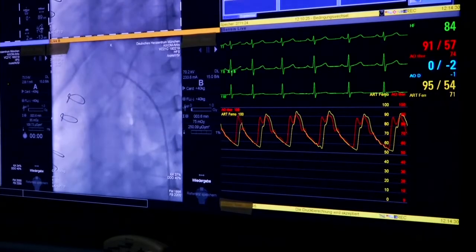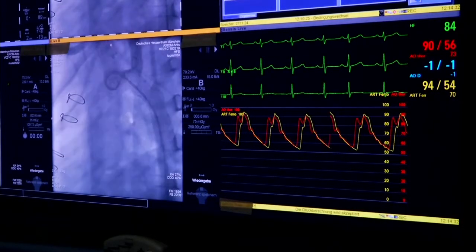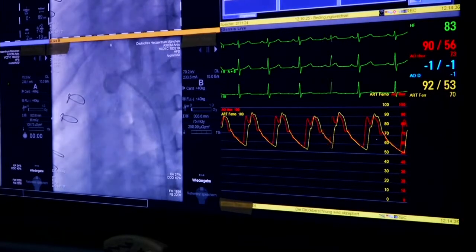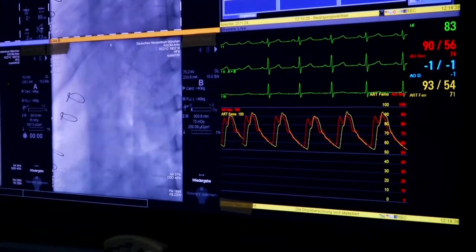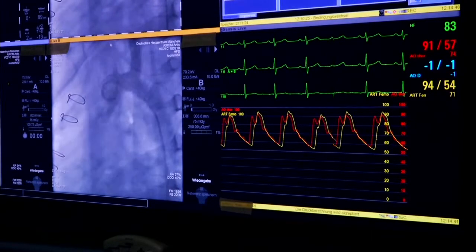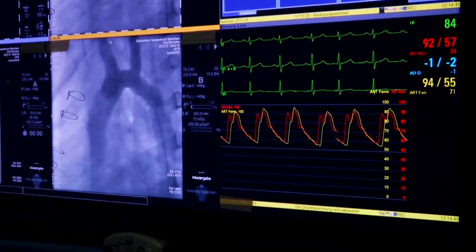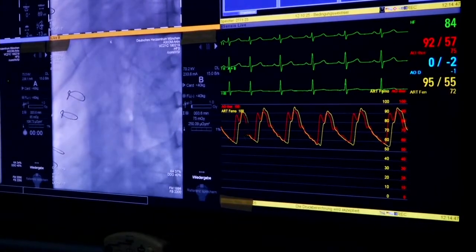The child has no arterial hypertension, so I think there is no need to make things more complicated at the moment, even if it's not an optimal residual gradient-free result. What do you think? Well, I think this is a reasonable plan.